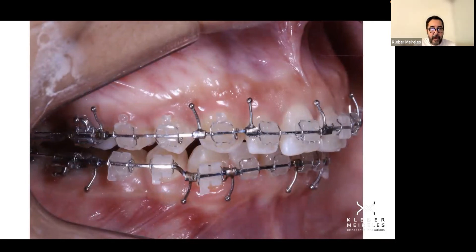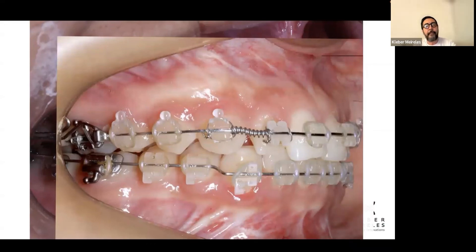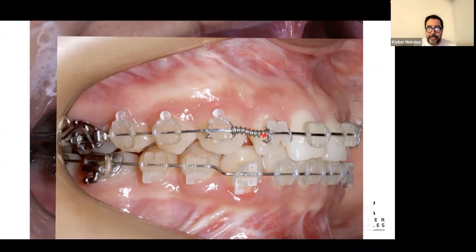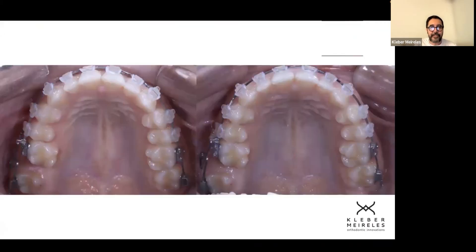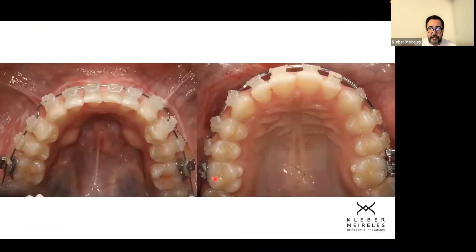The patient is now ready for surgery. To keep the anterior segment down, we do a passive step band here to maintain the position of the anterior teeth. After surgery, we are now about four months post-surgery, and we are dealing with the spaces because we have a size discrepancy on both sides. We're opening space to increase the size of those lateral incisors. Unfortunately, this patient can't open her mouth wide enough for better photographs of this position. But we have this step-by-step view during the mesialization of the posterior teeth, and here we have this space being closed. This is today.